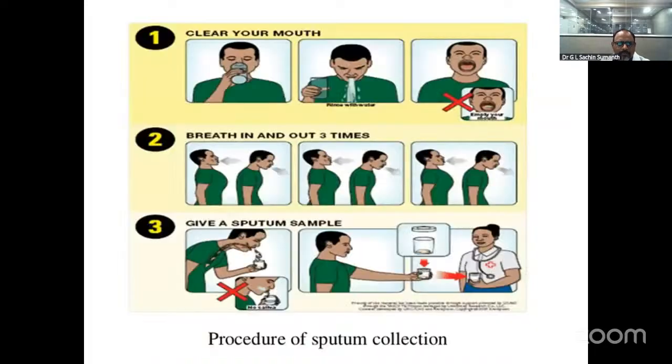This is also... wash the mouth, rinse it, then take a deep breath and cough it out into the container.